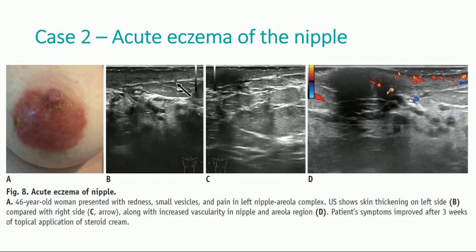Case number two: acute eczema of the nipple in a patient that presented with redness, small vesicles and pain in the left nipple-areola complex. The ultrasound shows a thickened and vascularized skin compared to the contralateral side. The patient's symptoms improved after three weeks of topical application of steroid cream.